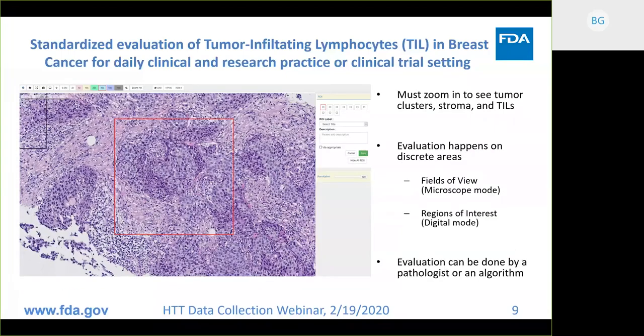Here's a zoom in of one of those areas, showing the cells, the tumor clusters, the stroma, and lymphocytes. In a microscope, they call this zooming in the field of view, or a high-powered field of view. In digital mode, we can mark out specific regions of interest. The evaluation can be done by a pathologist or an algorithm, and we are going to ask for the evaluations by both the pathologist and ultimately the algorithm.